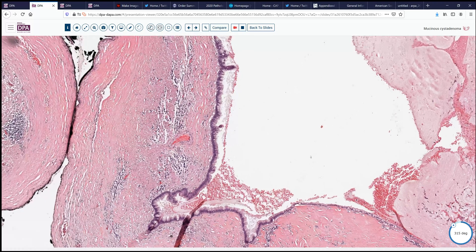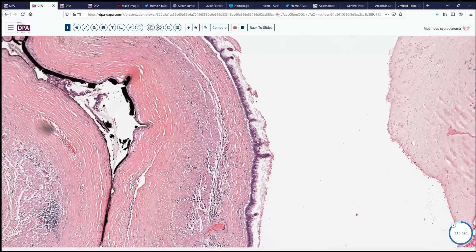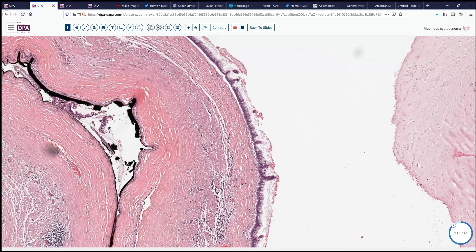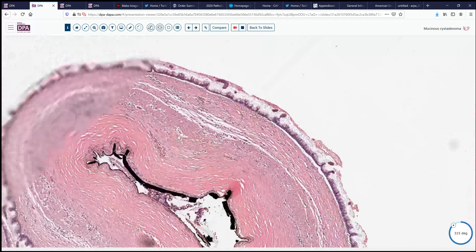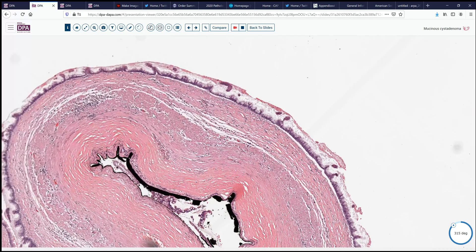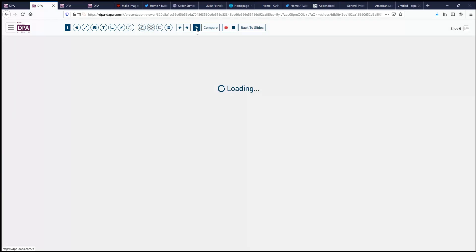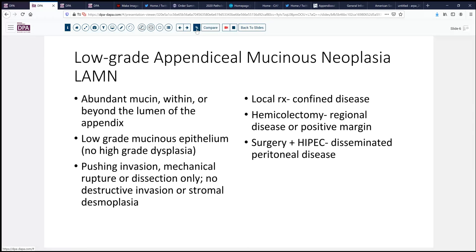And so that puts this into the category of low-grade appendiceal mucinous neoplasia. By definition, abundant mucin within or beyond the lumen of the appendix is required for this diagnosis, together with low-grade mucinous epithelium, no high-grade dysplasia. And we can see pushing invasion, mechanical rupture or dissection only — no destructive invasion.